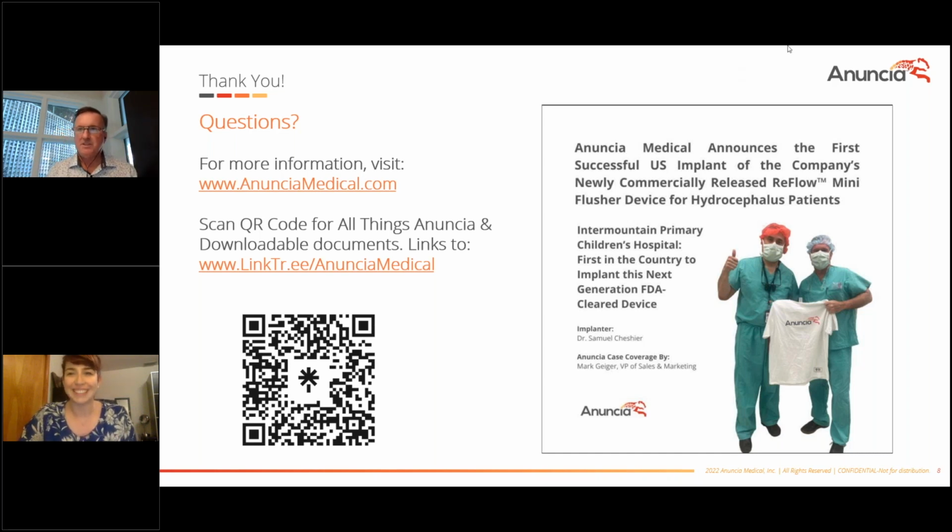Oh, you're muted. Sorry. It's a great question. The idea came out of Dr. Joe Madsen from Boston Children's, and we licensed the intellectual property from Boston Children's. Dr. Madsen is a very well-respected name in neurosurgery and in pediatric neurosurgery. He's still around and a great man if you ever get a chance to meet him. And the original ReFlow Gen 1 was designed as a rescue device, meaning the device would only be used when the patient was symptomatic of a shunt occlusion or shunt malfunction, specifically clogging of the ventricular catheter.